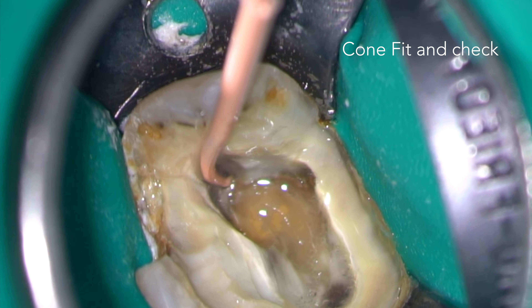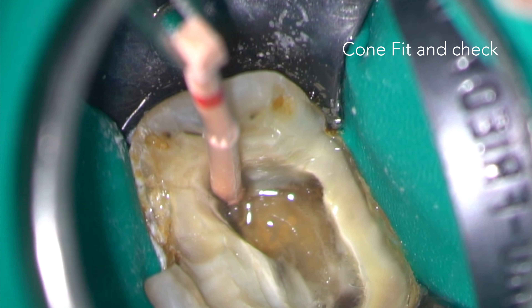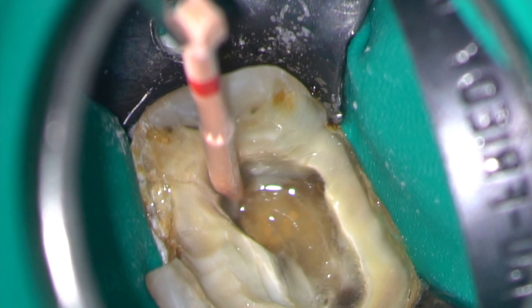I like to do my cone fitting with irrigant in the root canals. These GP cones can also be used to agitate the irrigant in GP pumping.